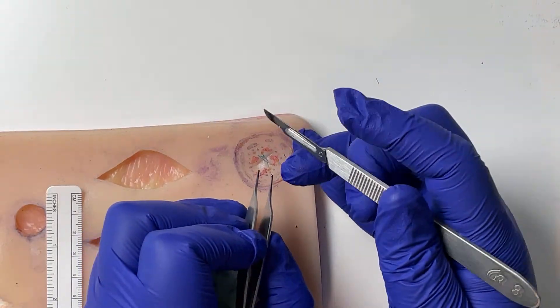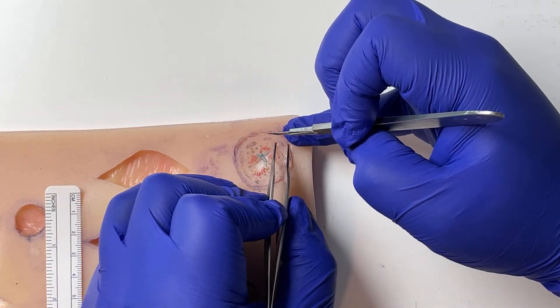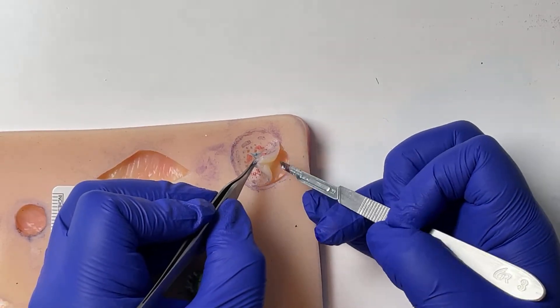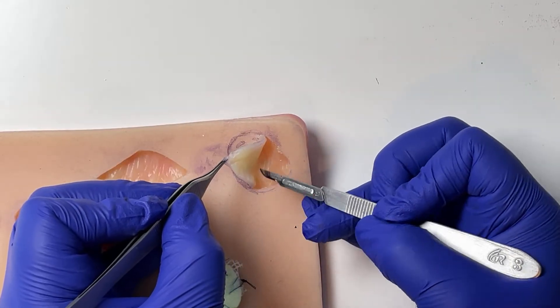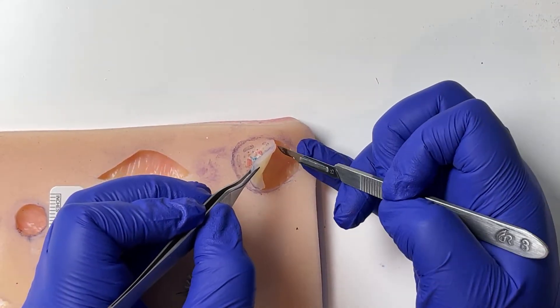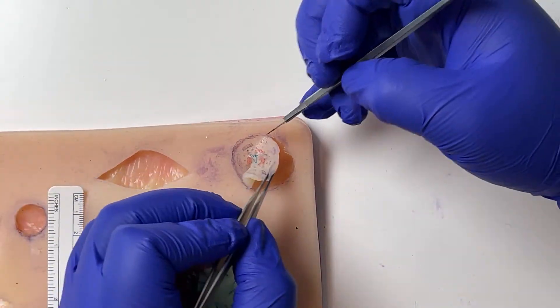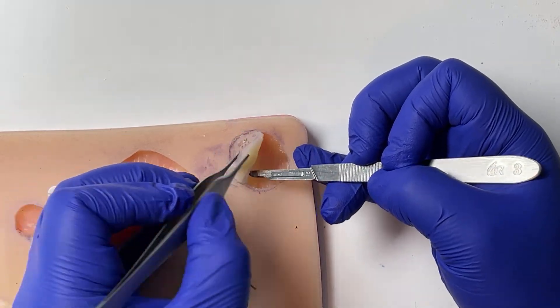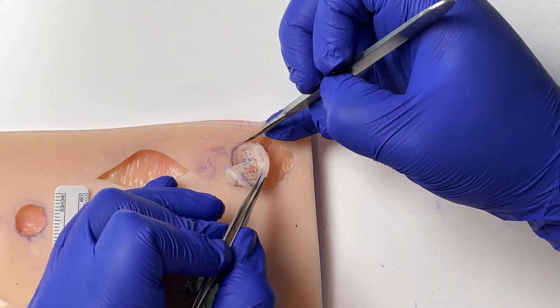Use your little finger to give yourself exposure, then sweep to match the depth all the way across. This hand is doing a lot of work pulling up, while the other hand pulls down, and you're just sweeping. We take it with a cuff of fat because it's a diagnostic excision biopsy. You want to get to the same depth everywhere, from top to bottom.